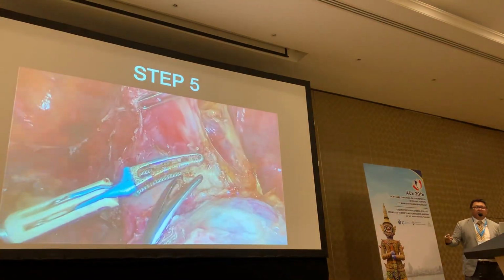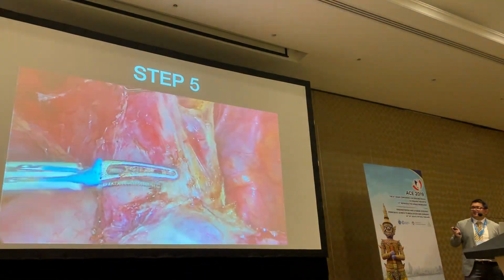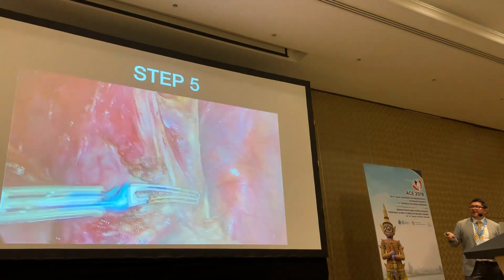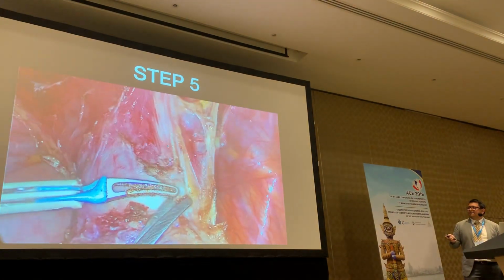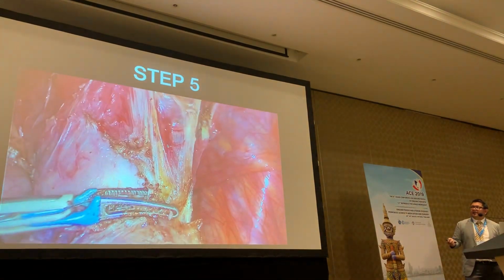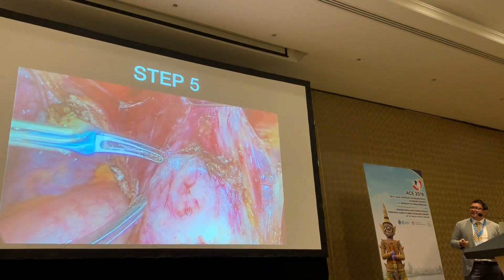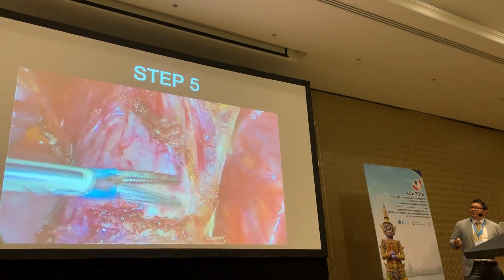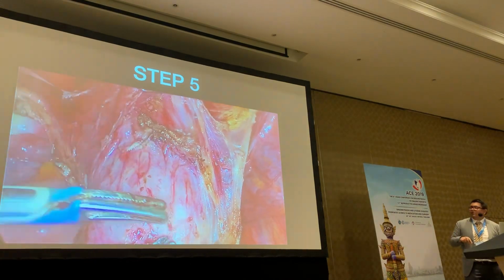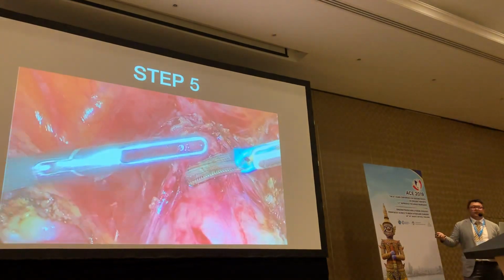So I alternately undermine with the bipolar, giving it a short burst to not allow the bleeding. And my vaginal assistant is retroverting and pushing very far up. So this is giving me traction and counter-traction to do my dissection. As you swing across from lateral pillar to lateral pillar, use the blunt end of the bipolar to push the tissue away. So you can see the fascia, which is just by producing the traction, and the carbon dioxide creates your plane for you, and you can push it down bluntly or just make a small cut towards the uterine end. Catch all the residual capillaries that have decided to announce themselves over here.